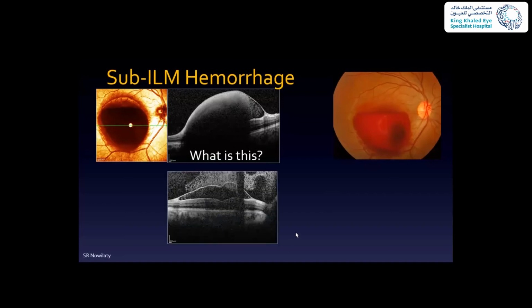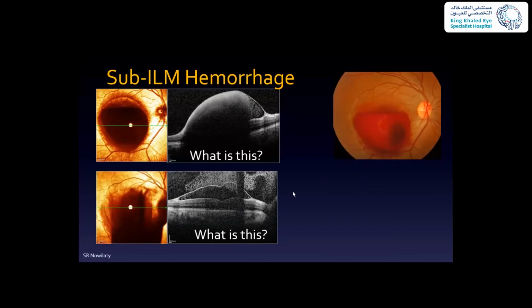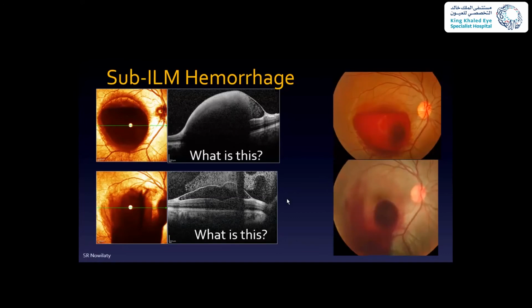And what we did here is we created a break with a YAG laser. We evacuated the blood, to permit the eye to see better. And you can see all the blood that was evacuated here. The ILM pocket is now more or less empty. After we did the YAG laser, the blood went down, and it is still going down. Here is the original pocket, and the fovea is free. So this ILM detachment, by the way, never really sticks back to the retina. We've noticed that it just stays there.